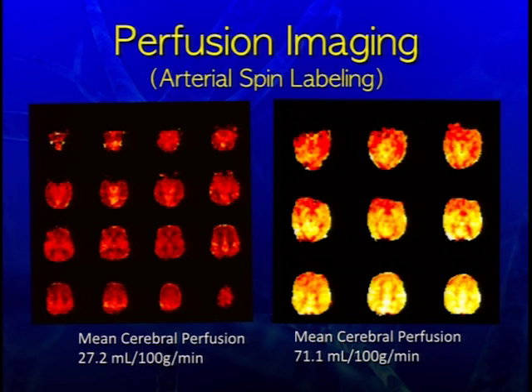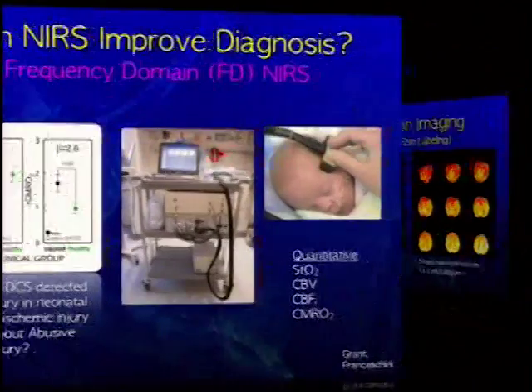When we've been looking at the acute concussion kids, ages 8 to 20, that don't have parenchymal injuries, we're seeing cerebral blood flow actually correlating with their symptomatology, with higher blood flow correlating with higher symptoms. So I think this cerebral blood flow imaging may be very helpful as we move forward at detecting injury and maybe having another marker when the rest of the imaging is normal, this child might have taken a hit. The challenge right now is getting good quantitation and having good normative values to compare to.